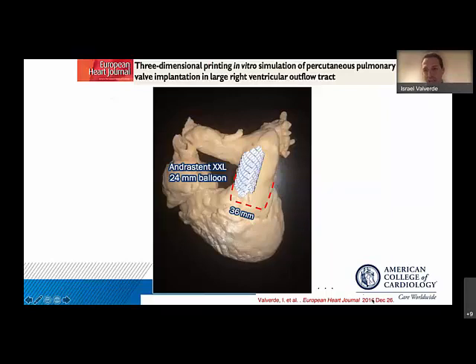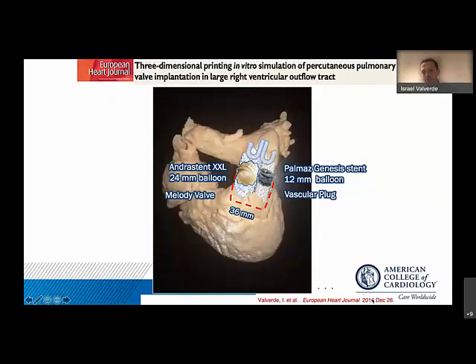So we had a very fair idea, which is: why don't we use a dual stent? One stent for landing and another stent for giving support for the pulmonary, for the Melody valve. Because we have a landing zone using a Palmaz Genesis stent, we could close this stent using a vascular plug. As you can see, it's a very high-risk procedure. It's crazy, but we had no option because no surgery could be planned.